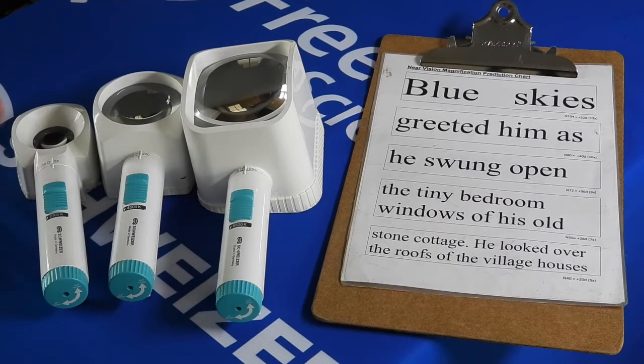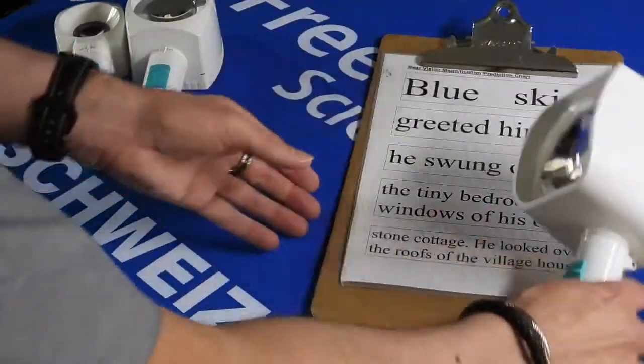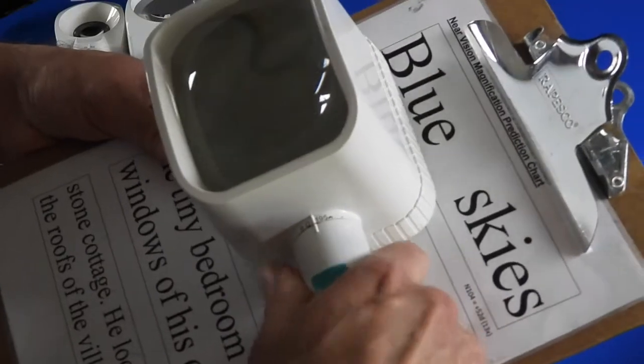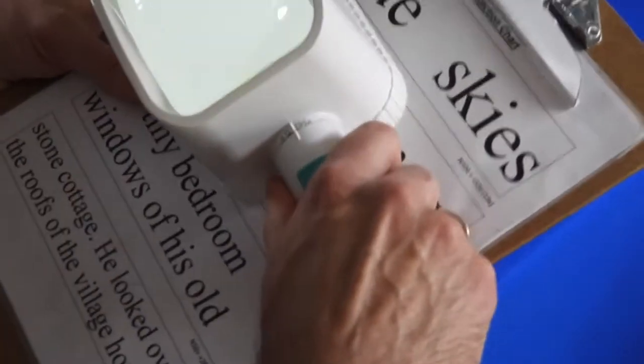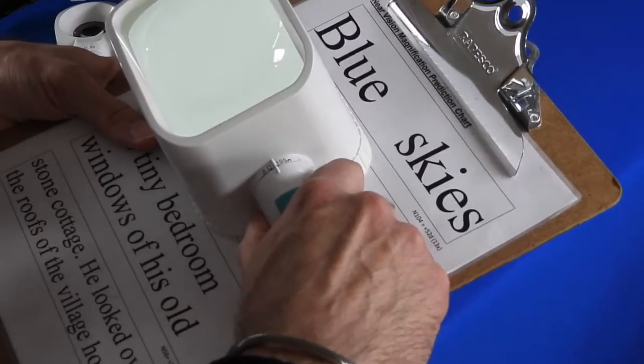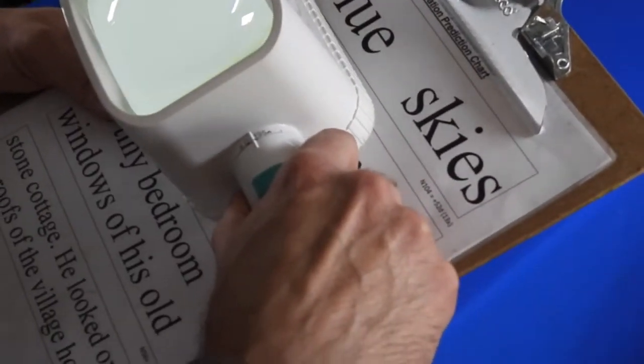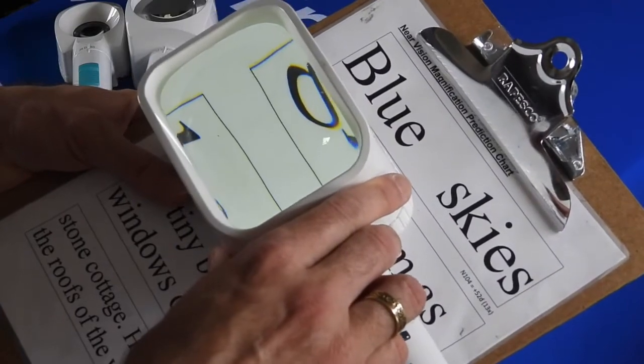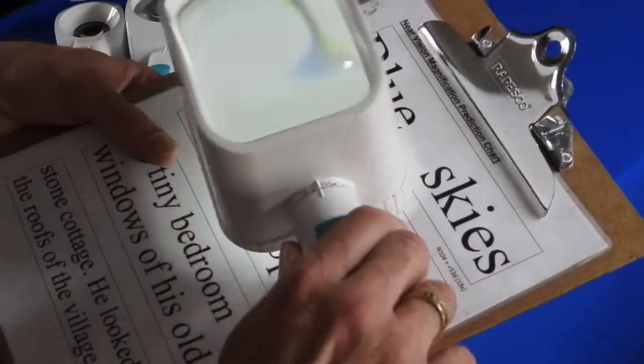In the exact same way as a hand magnifier, you have to hold the magnifier at a set distance and then move your vision and your eyes closer to the lens to get it into focus. One of the benefits of a stand magnifier is that the head is already set to the correct focal distance.